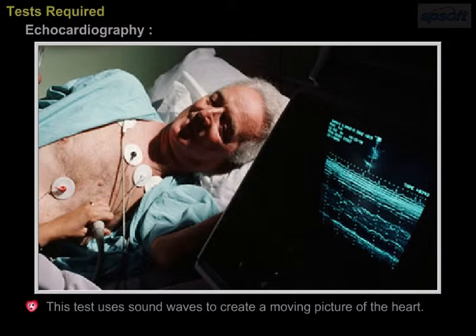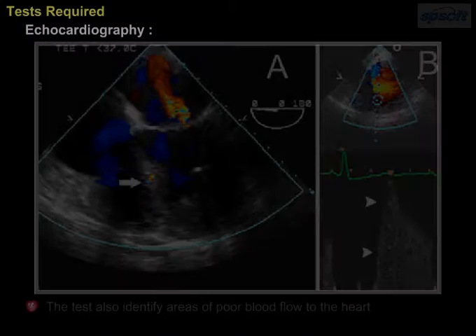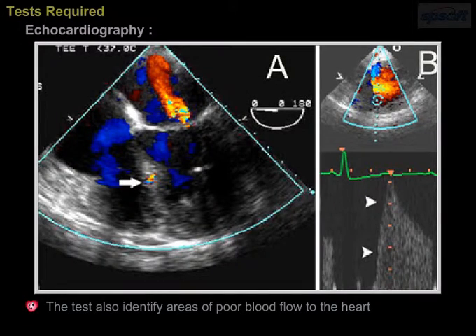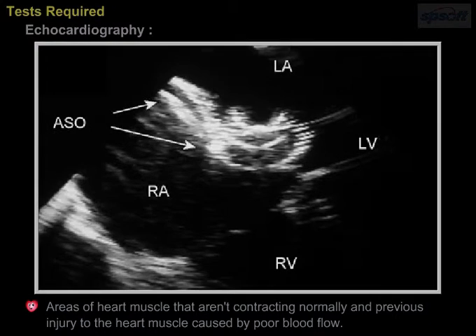Echocardiography. This test uses sound waves to create a moving picture of the heart. Echocardiography provides information about the size and shape of your heart and how well the heart chambers and valves are working. The test also identifies areas of poor blood flow to the heart, areas of heart muscle that aren't contracting normally, and previous injury to the heart muscle caused by poor blood flow.